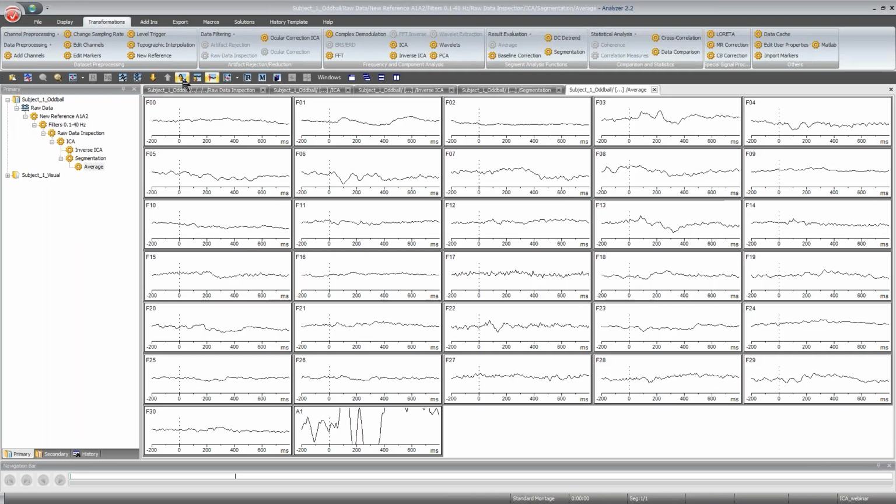And then maybe, because there are some papers, for example, that say, okay, we want to use ICA for reduction of our data set. So we just use the ICA components that we bring together with some ERP process that we want to look at, and we forget about everything else.